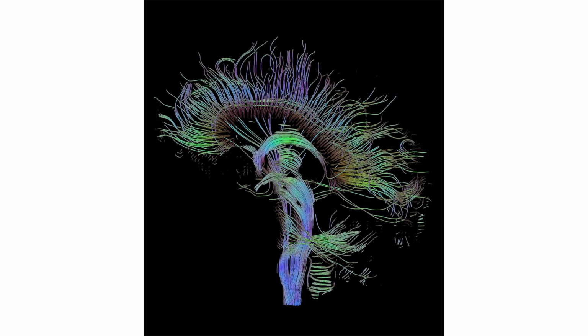Barriers can be many cell membranes, axons, myelin, etc., but in white matter the principal barrier is the myelin sheath of axons. Bundles of axons provide a barrier to perpendicular diffusion, and a path for parallel diffusion along the orientation of the fibers. Anisotropic diffusion is expected to be increased in areas of high mature axonal order. Conditions where the myelin or the structure of the axon are disrupted, such as trauma, tumors, and inflammation, reduce anisotropy, as the barriers are affected by destruction or disorganization.